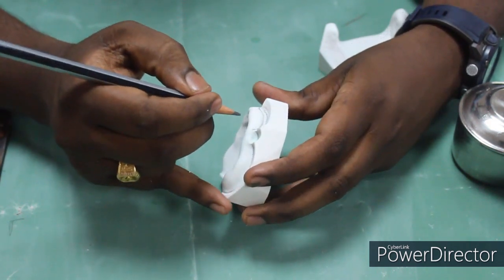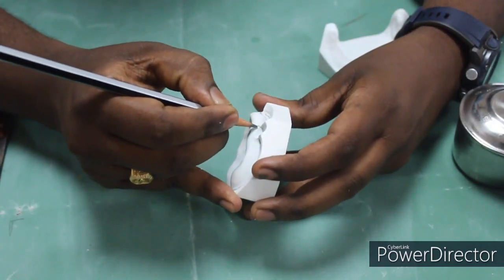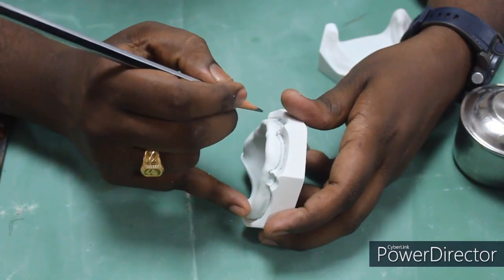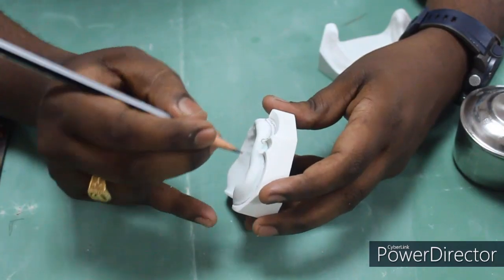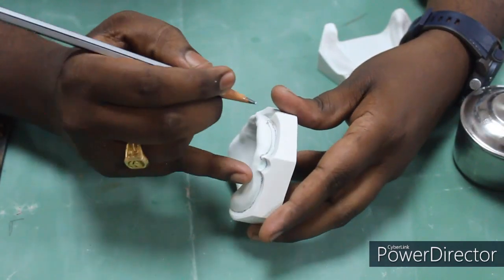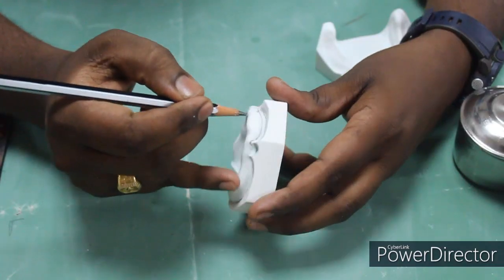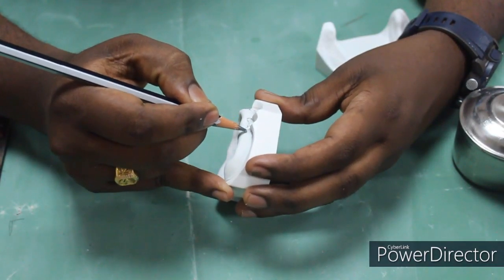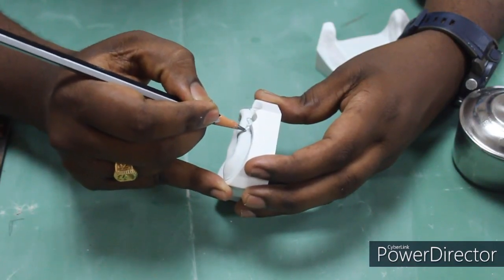If you notice here, I am making a U-shaped depression in the frenum area. Why? Because the line should not be straight. It has to follow the anatomical curvature of the area. For example, in the frenum you have to give a V-shaped relief for this tray line, and in the buccal frenum you have to give a double relief because there are 2 frenum attachments in this area.